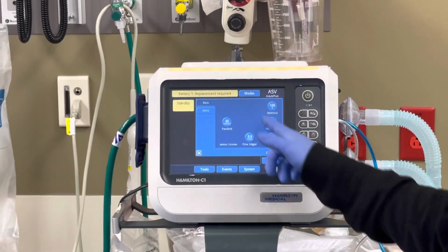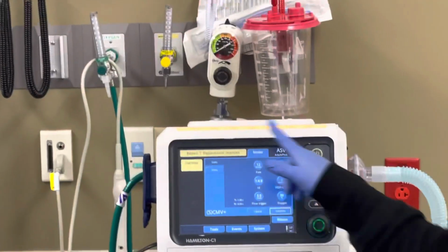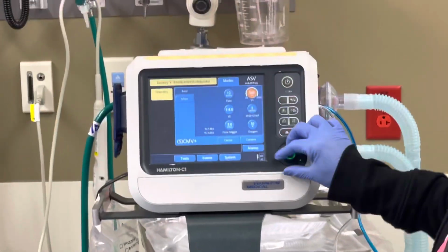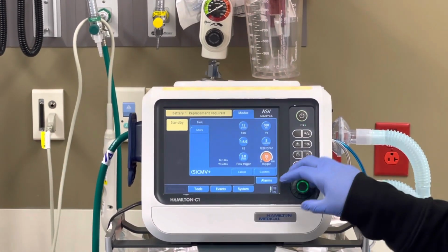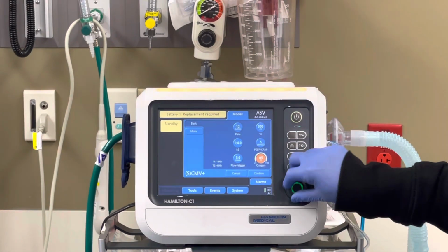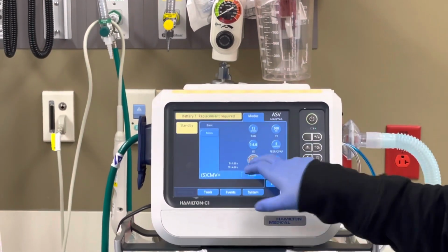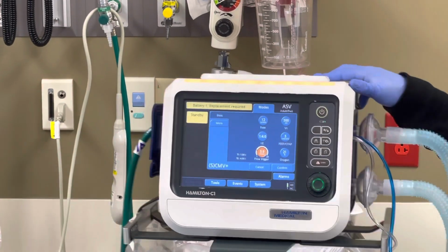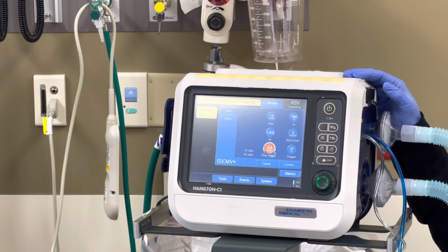Okay. And think about this one too, if you don't finish what you're doing, it will automatically kick you back out. So I'm gonna just start a PEEP of 5. We're gonna say that the patient needs to be on 100%, but I'm just gonna put it on 21 for now, okay? So for my flow trigger, I usually, on the Hamiltons, I'll turn it down to 2.